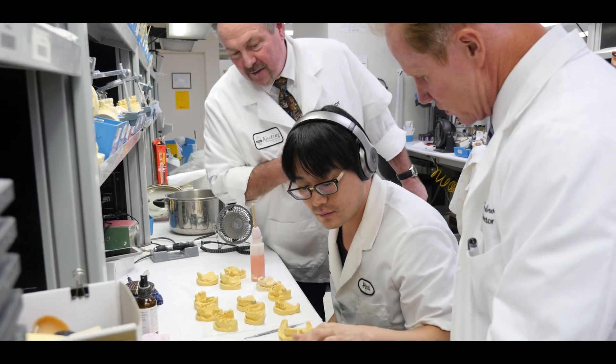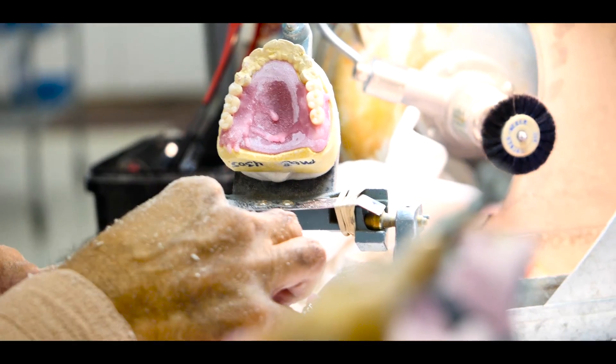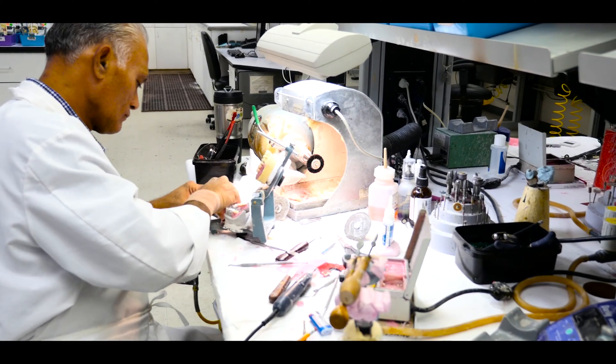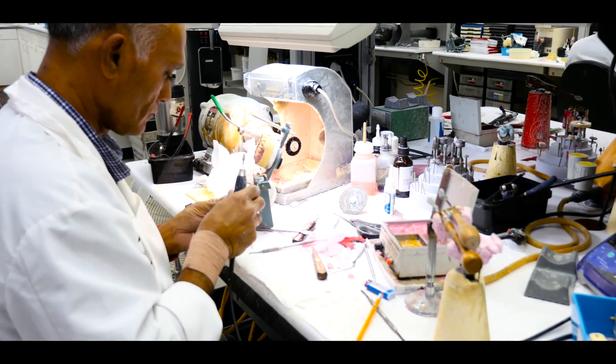Jim, you're doing a bunch of cool things — I'm up there all the time exploring and meeting with the technicians. You're doing a lot of cool things up there, but really what I want to do now is talk a bit about the dentures. At Keating we have basically three categories of dentures, and we start with the KDA denture. Why don't you go ahead and elaborate on that?